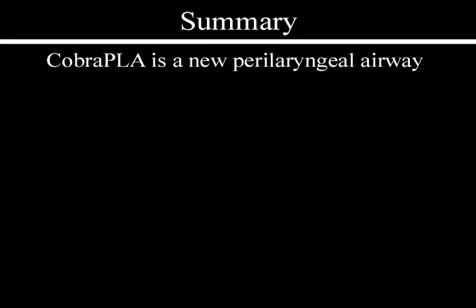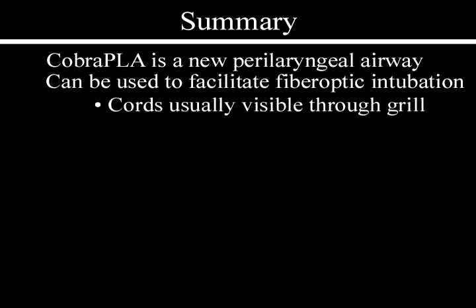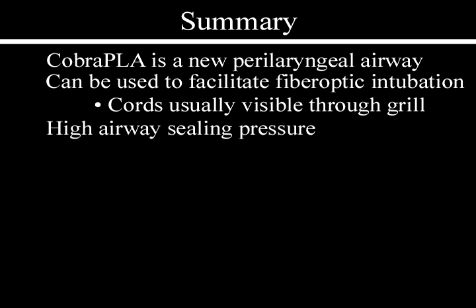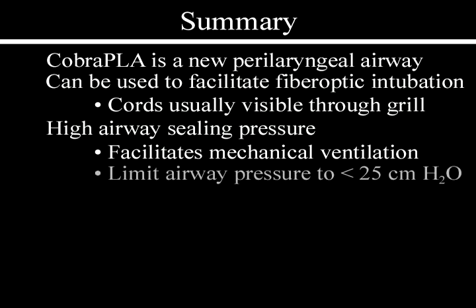In summary, the Cobra PLA is a new perilaryngeal airway. It can be used to facilitate fiber optic intubation. The cords are usually visible through the grill. High airway sealing pressures are characteristic of the device, and this facilitates mechanical ventilation. Ventilatory inflation pressures should be limited to 20 to 25 centimeters of water to prevent gastric insufflation. The airway is easy to insert and easy to use.